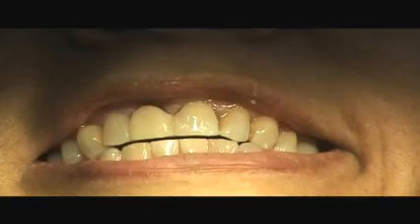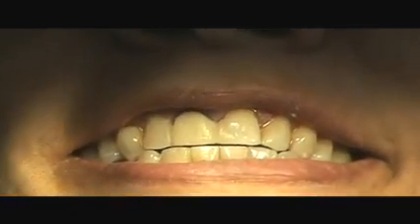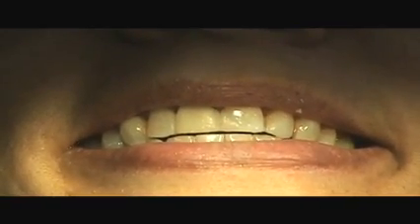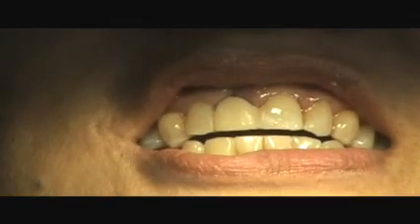After cleaning the bridge, the patient can view the completed prosthesis close up for the final time and become familiar with the bite, shape, shade, and contour. Asking the patient to speak is a means of checking thickness and acceptable length that may affect word articulation and phonation.